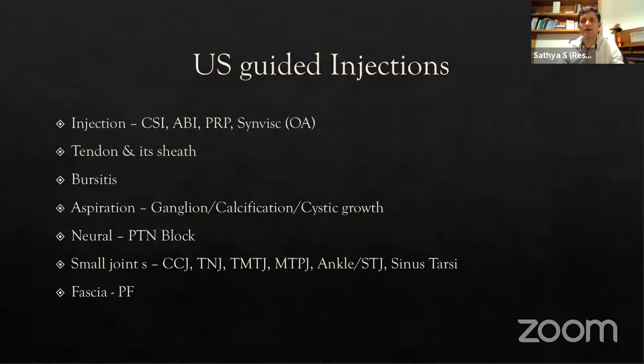I had a patient recently, post medial meniscus injury, who developed a cyst on the medial side of the knee joint. I was able to see the tendons flicking over the cyst, and referred the patient to the sports doctor, and he called me in to show me when he was aspirating using ultrasound. After that he used corticosteroid to settle it down, and within 4 weeks the patient was totally okay, there was no more flicking of the tendon on the cyst, and the cyst has completely resolved. But before the ultrasound guided injection, the person had an MRI scan taken.